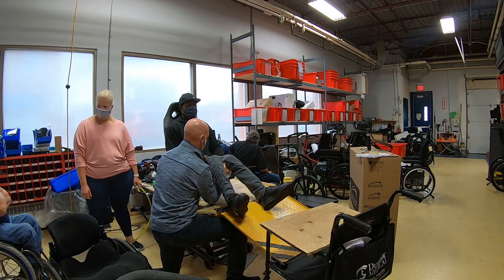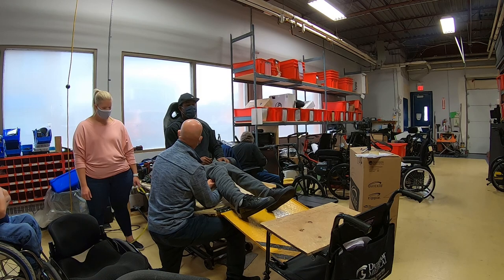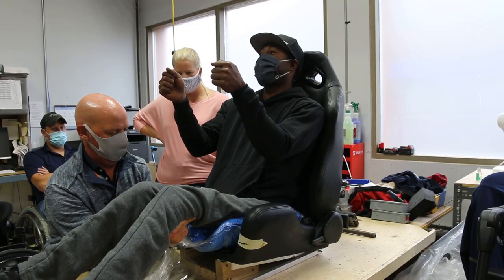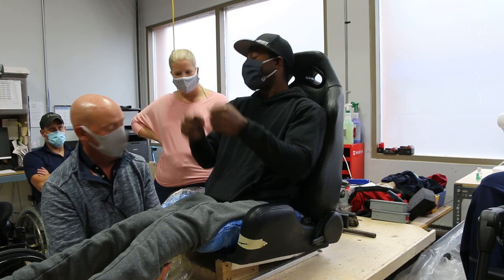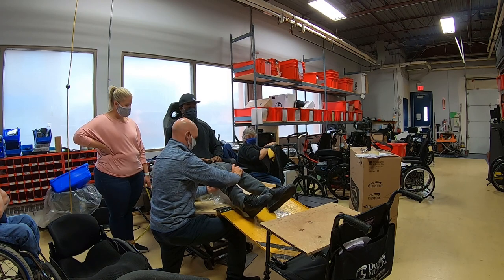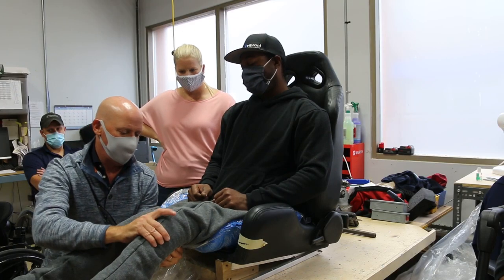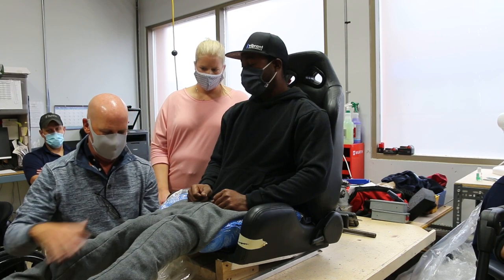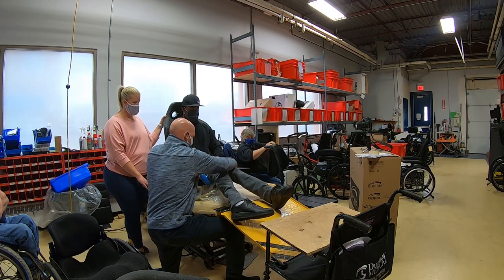Just imagine that from your balance point. Better — that's your balance. Why don't you pull that out if it's a solid unit? I like down better, yeah. Because then they'll have to do... you have an internal rotation when you come down — your legs are sort of rotating like that. I can't sort of force it out, and your range of motion doesn't like to go up there. So that's your position. Your feet sort of end up doing that because you have an internal rotation. I've kept your legs apart and brought that up pretty high so you're in there.